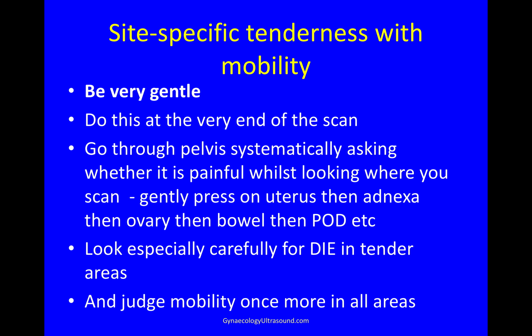Go around it in a logical sequence, looking especially carefully if an area is very tender. Look for DIE, because you'll probably find some if you haven't already seen it. And judge mobility once more in all these areas.